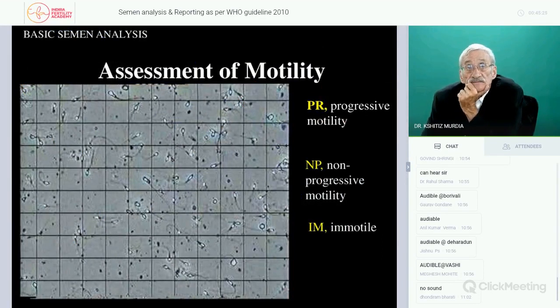Assessment of motility, we will discuss this. This video didn't work, so it's PR, NP, or IM.